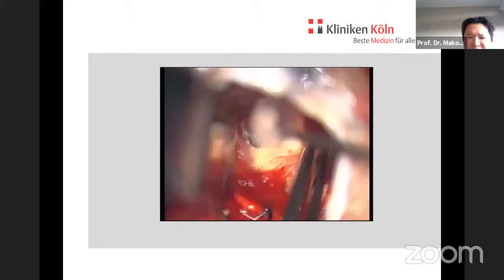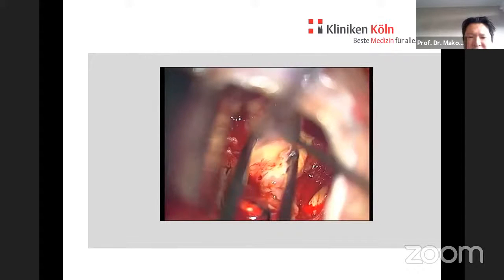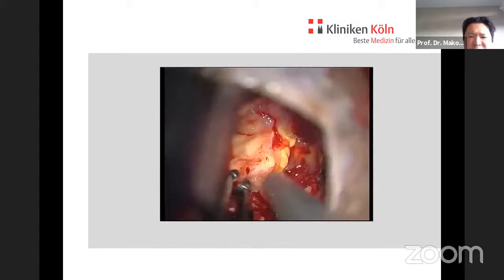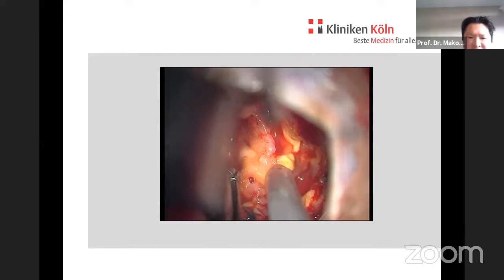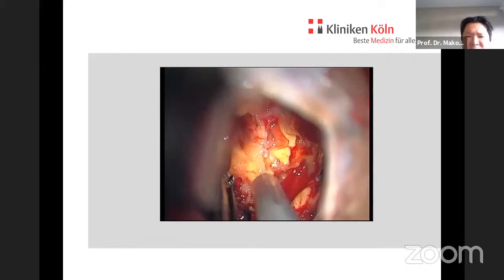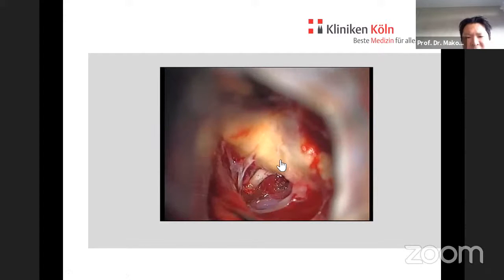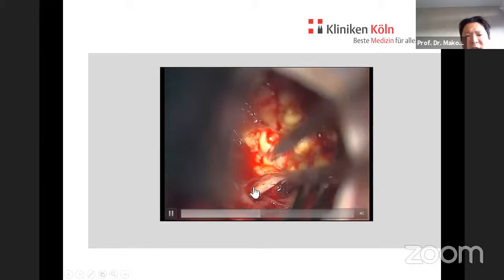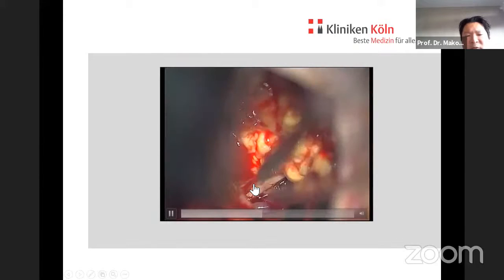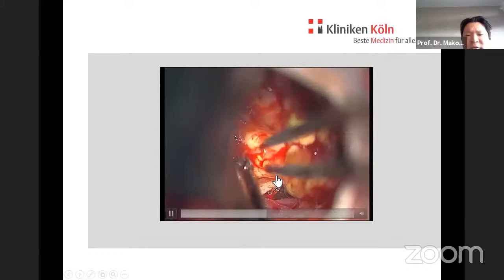And then at the brainstem, the exit of the facial nerve is every time the same. So this is the place where the facial nerve can be identified anatomically. Of course, you have neuromonitoring, and neuromonitoring is really, really important to check. And this is the facial nerve here. So the facial nerve is coming out of the brainstem. Do some stimulation there. And then it's possible to follow the facial nerve.